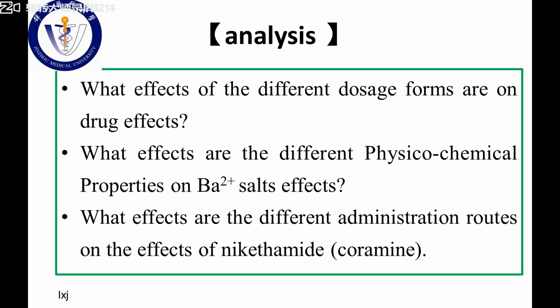For these 3 small experiments, for example pentobarbital in different dosage forms, mucilage or solution, some students got the opposite result. Can you analyze why? Actually, because you are students, your injection and operating skills on animals are not very proficient.